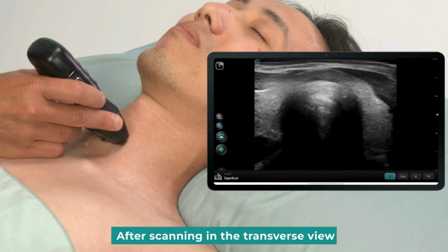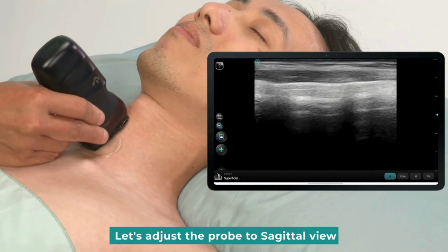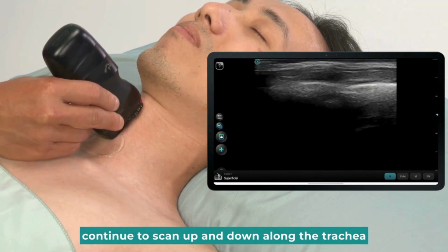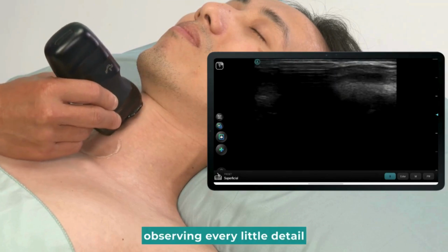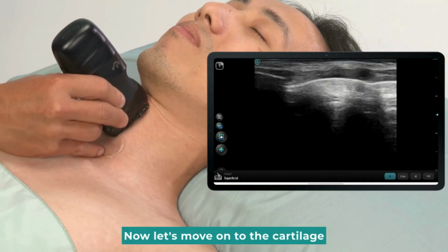After scanning in the transverse view, let's adjust the probe to sagittal view. Continue to scan up and down along the trachea, observing every little detail. Now let's move on to the cartilage.